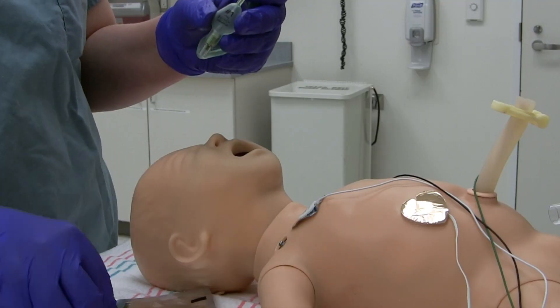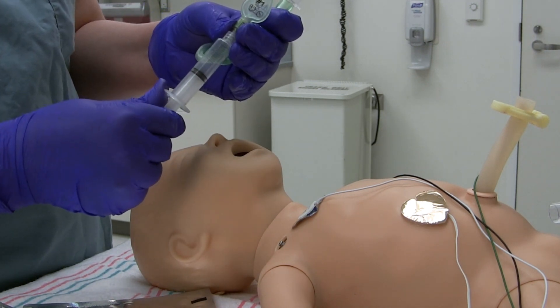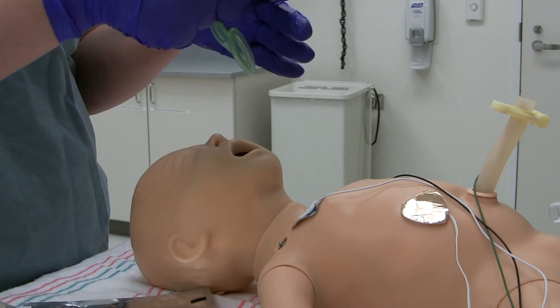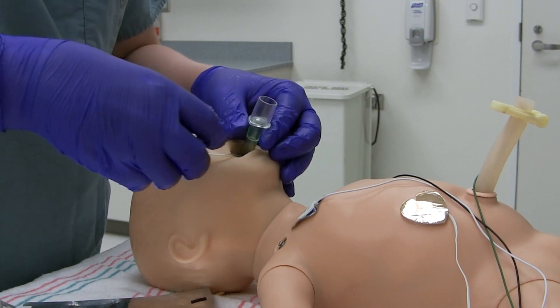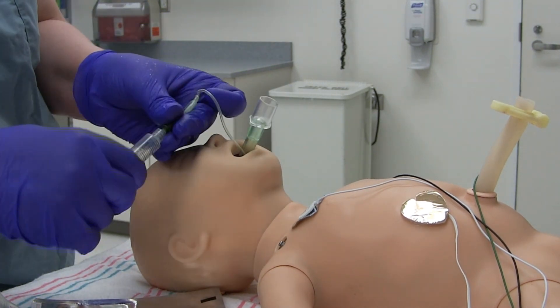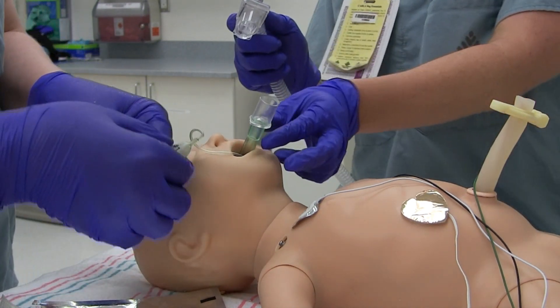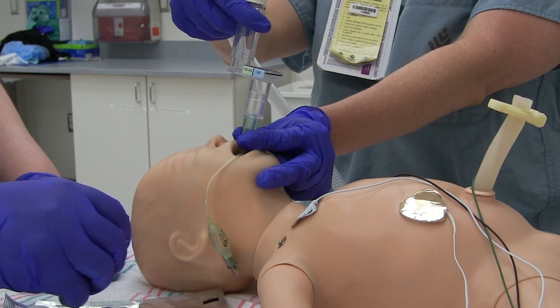To place an LMA, deflate the cuff around the mask and remove the syringe. Open the baby's mouth and press the tip against the hard palate. Advance the LMA inward with a circular motion. Stop advancing when you feel resistance. Then inflate the cuff to seal the mask over the airway. Initiate PPV and check for CO2 detection as you would for an endotracheal tube.